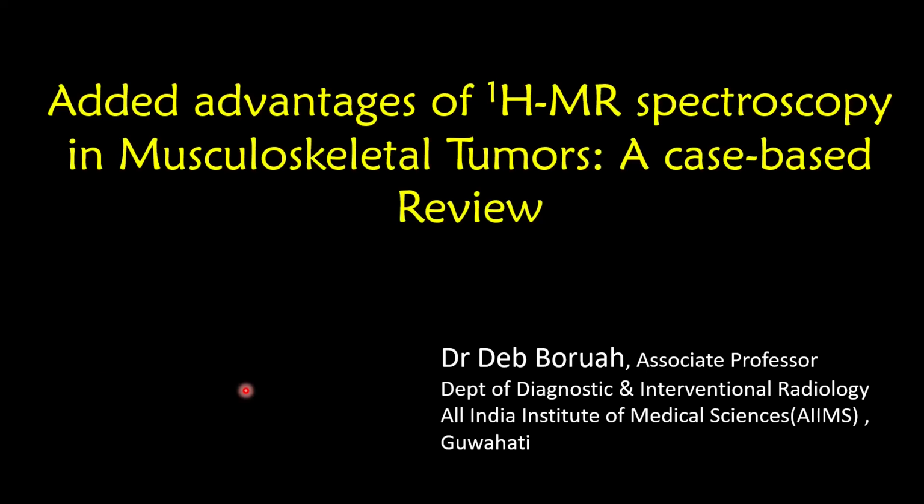So today I'll be talking on what is the added advantage of spectroscopy in MSK tumors. I'll be showing around 13 cases. I'll show my experience in MSK tumors, how spectroscopy helps in diagnosing and differentiating various tumors.